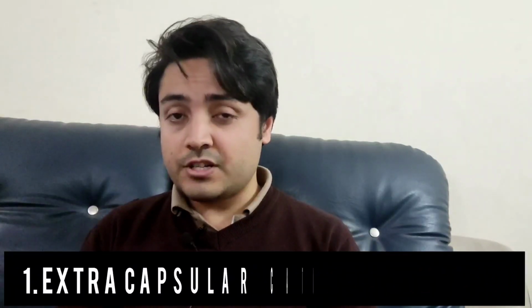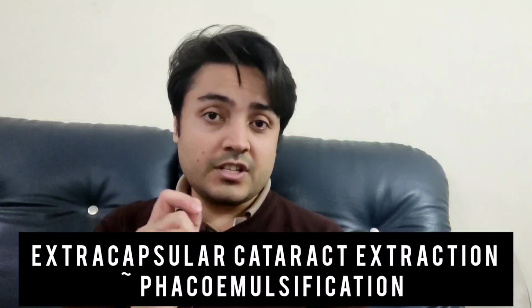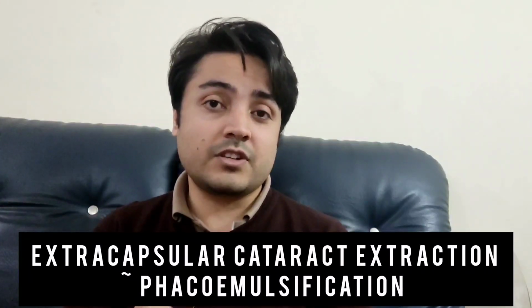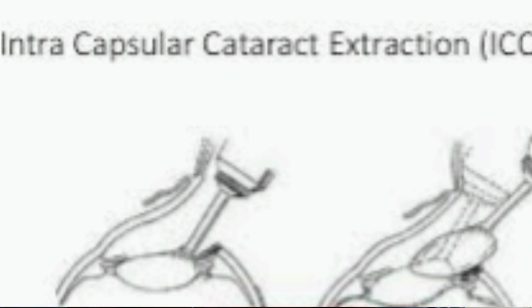Now, we need to know first how many types of surgeries there are for the removal of cataract, and which surgeries used to be done but are now obsolete. So there's extracapsular cataract extraction, intracapsular cataract extraction, and pars plana lensectomy. Well, it's rarely used these days. Now, extracapsular cataract extraction is what we are going to discuss today because phacoemulsification comes in this type. As the name suggests, extracapsular means the capsule stays but the lens is removed. Intracapsular means that the lens matter is removed with the capsule. This procedure was practiced until the 1970s and 80s, but when phacoemulsification was introduced, this became obsolete.